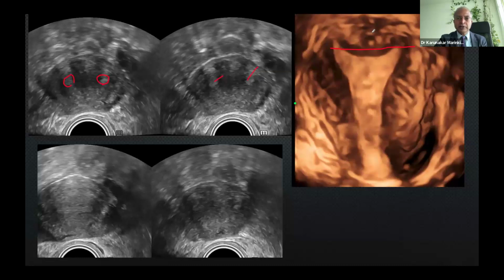myometrial indentation secondary to adenomyosis. You won't recreate any healthy environment there. It's already hypertrophic, with a lot of scar tissue there. You will not gain anything. You can just make her bleed, creating sinuses and tunnels of bleeding.